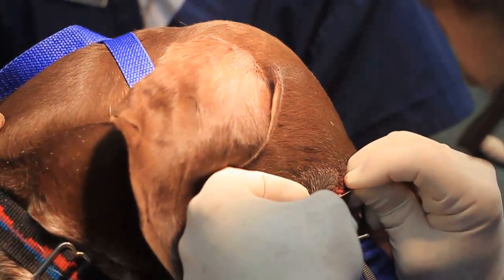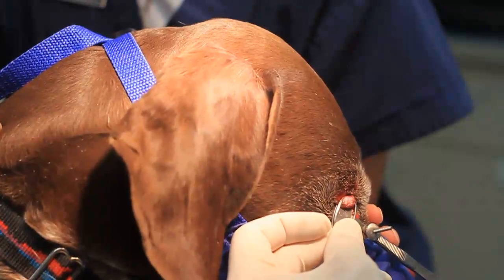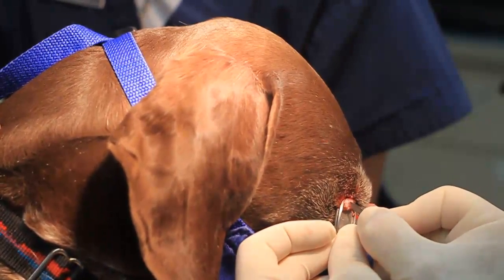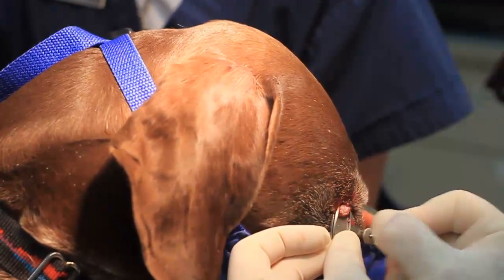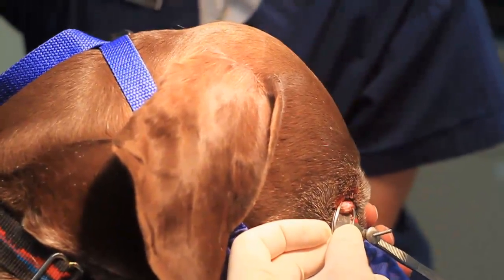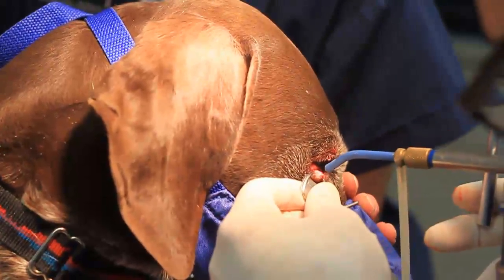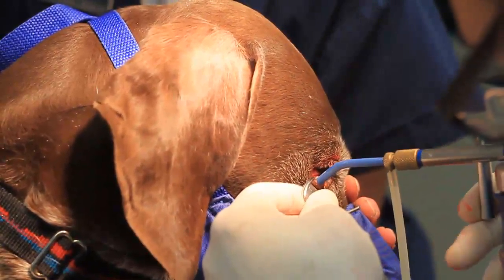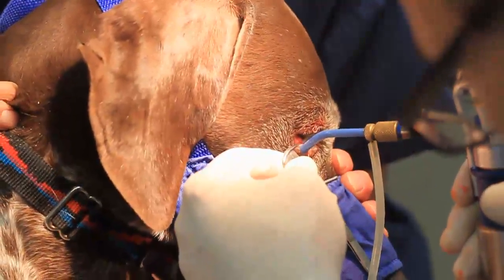If it's a show dog you have to be much more careful. There we carved it out and we're all the way down to the shiny tissue — that's as far down as we need to go. Now we're going to take this liquid nitrogen canister, which you can get through Butler Schein, and I'm just going to put a probe on there and freeze.